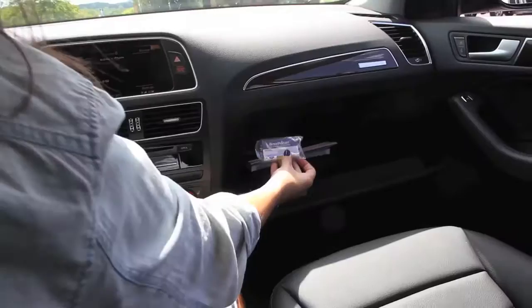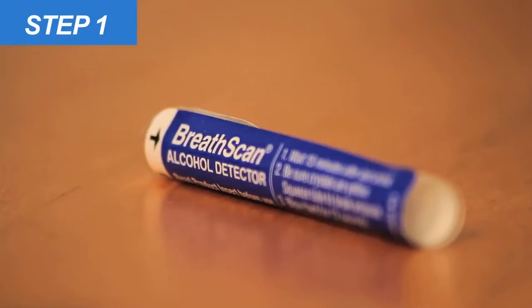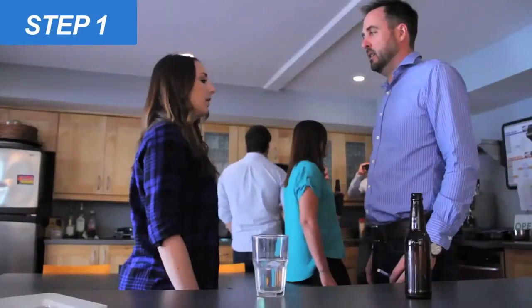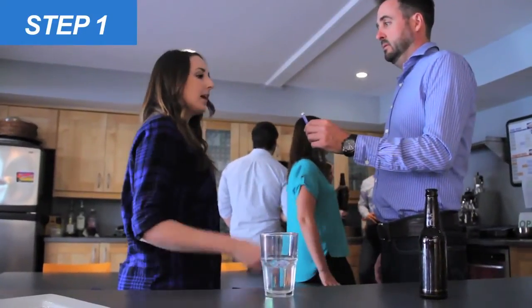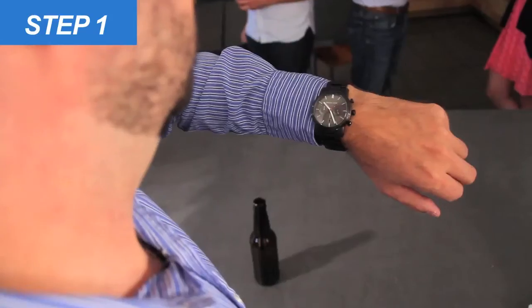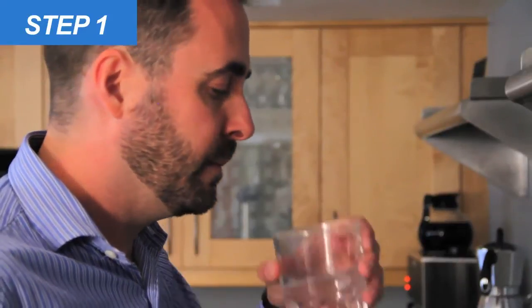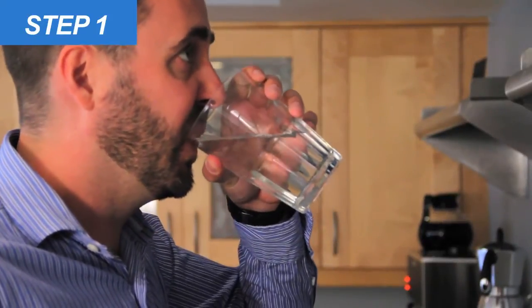Step one: the BreathScan alcohol detector is not a self-test. Someone who has not been drinking should help conduct the test and read the result. Subjects should wait 15 minutes after their last drink before taking the test. If you cannot wait, have the subject rinse their mouth with water to eliminate alcohol vapors.